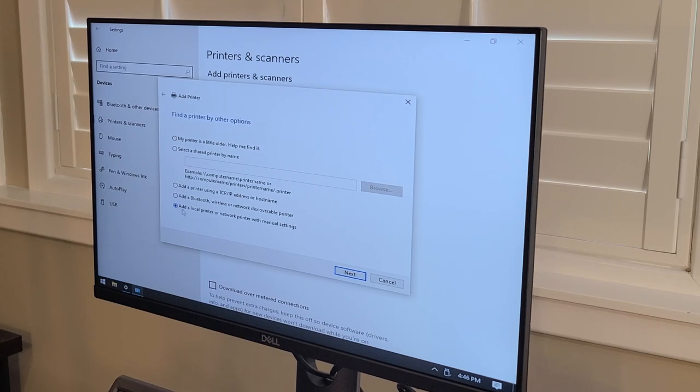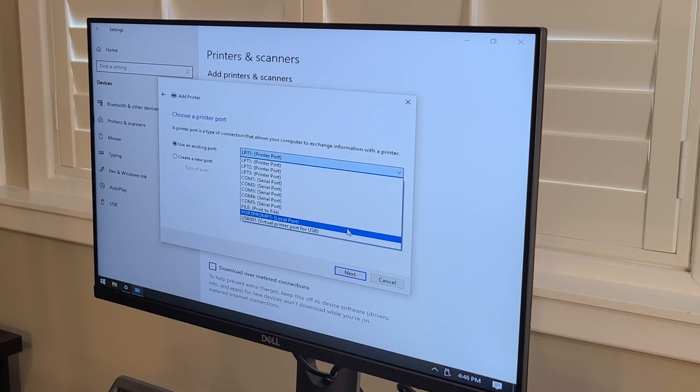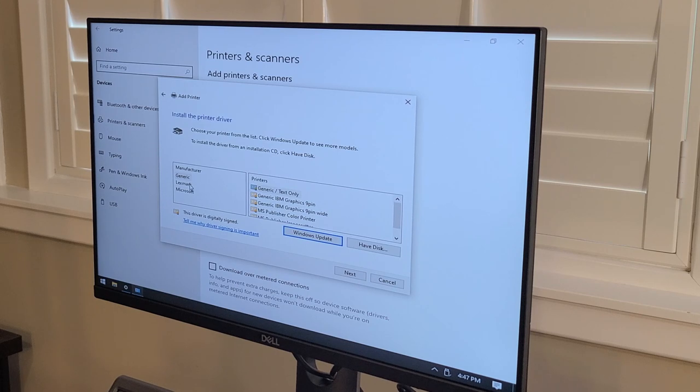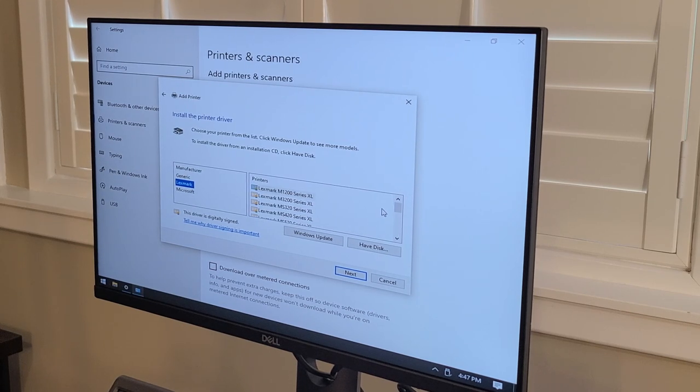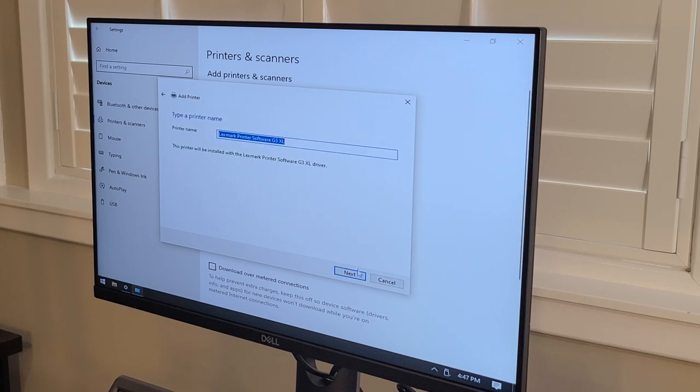And we already connect the USB cable of the printer to the computer. So we can click here, say add a local printer or network printer with manual settings. Say next. And then use existing port because we have a USB port for that printer. Then we click next. And it's a Lexmark printer. Now don't worry about the model, the B2338 of this Lexmark printer because there's none. This one is very hard. You have to say Lexmark printer software G3 XL. And then you click next.